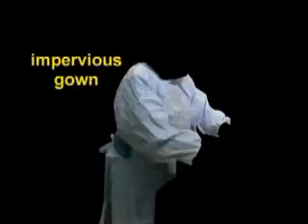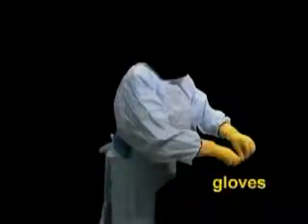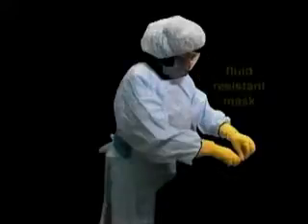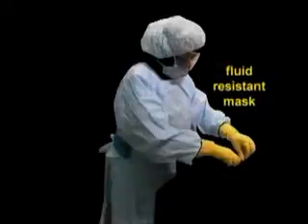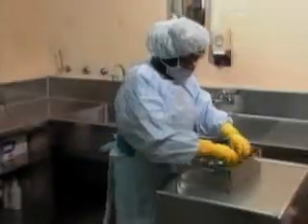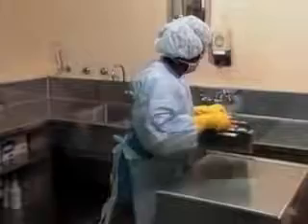Personal protective equipment may include an impervious gown or long-sleeved apron, with cuffs that are completely covered by gloves long enough to prevent water from entering when the hands are submerged. Other essential protective equipment includes head and shoe covers, face shields or goggles, safety glasses, and a fluid-resistant mask. Each piece of personal protective equipment may be reusable or disposable.